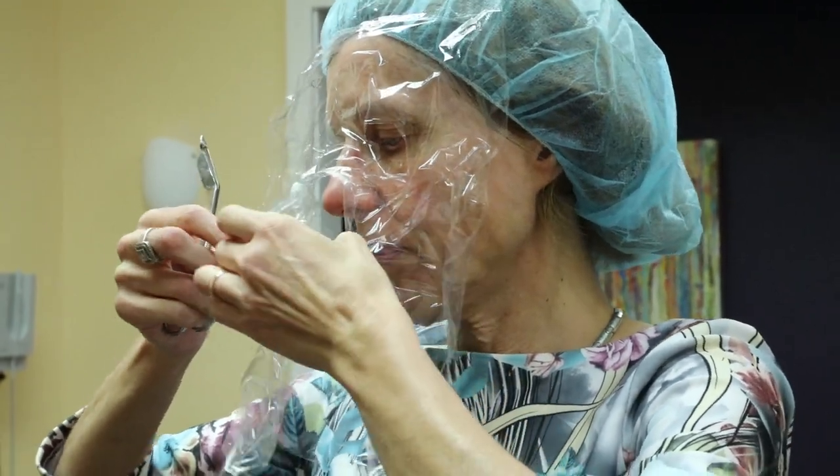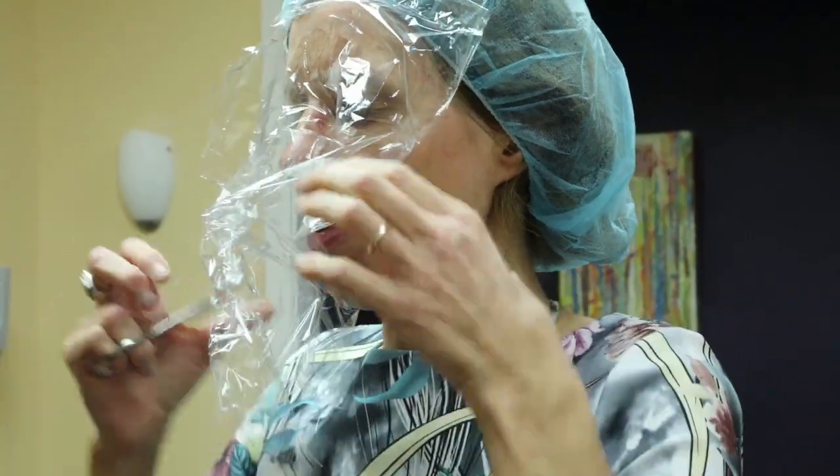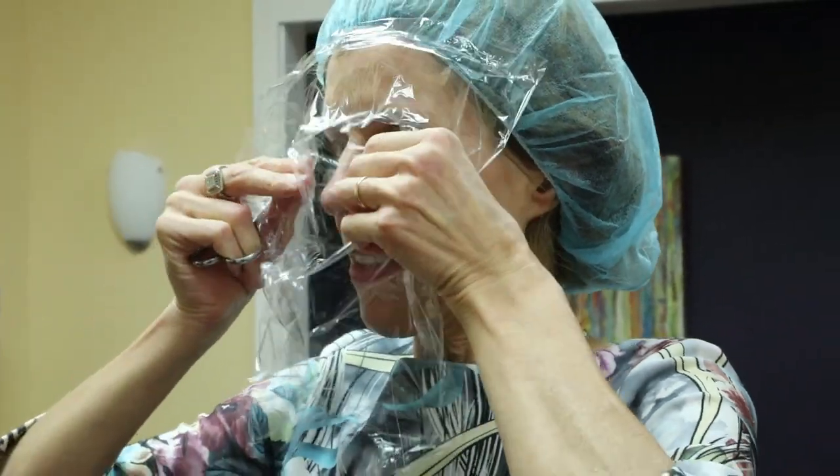Ultimately, there is no right or wrong with this mask — it's just what fits.